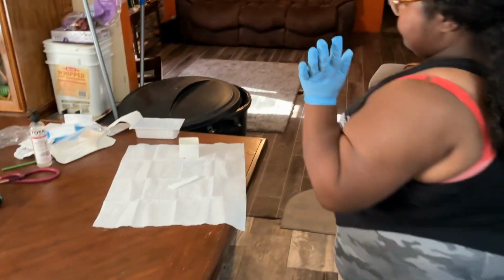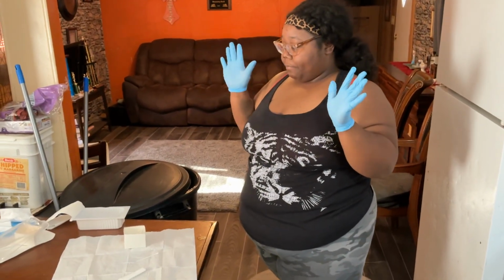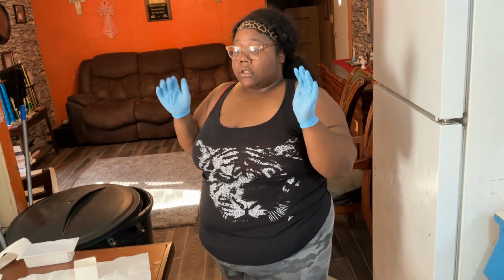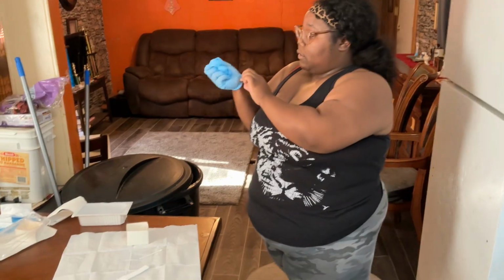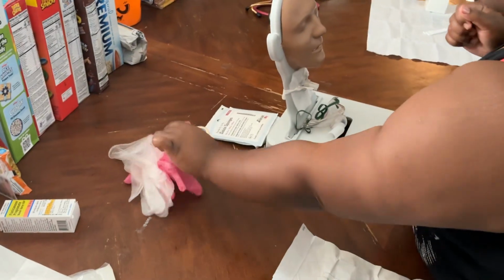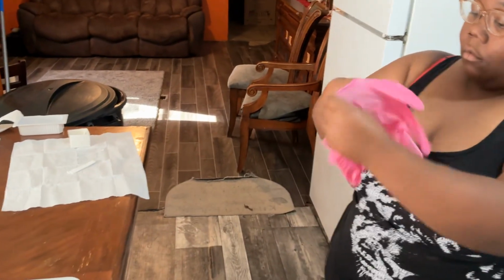Next, I don't need my sterile field anymore because the patient's stoma has been cleaned, dried, and dressing has been replaced. So I'm gonna remove my gloves. I would throw that away in the appropriate bin. So I'm gonna perform hand hygiene. I'm gonna put on my regular gloves.